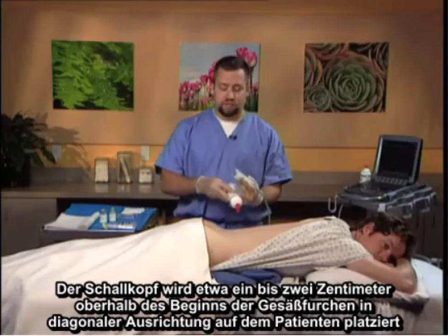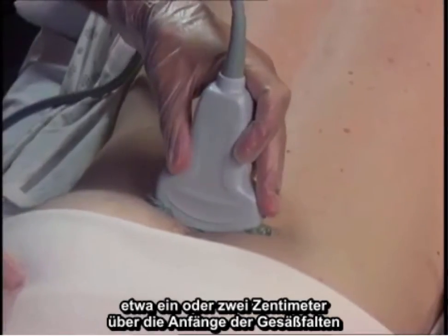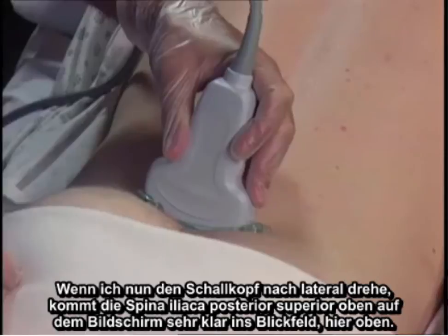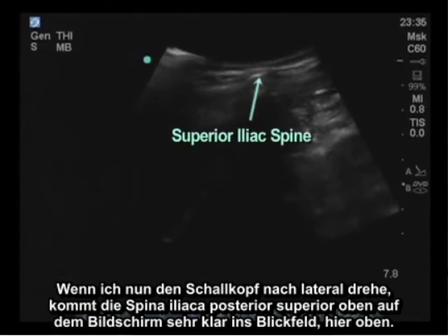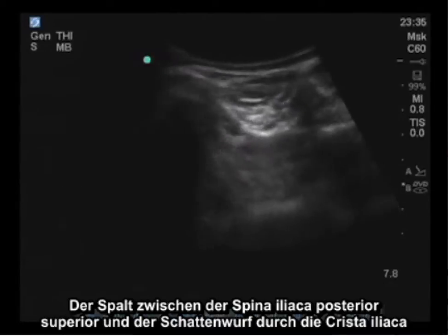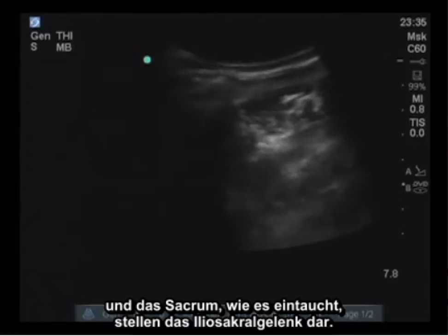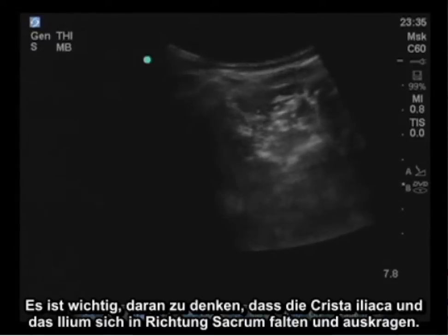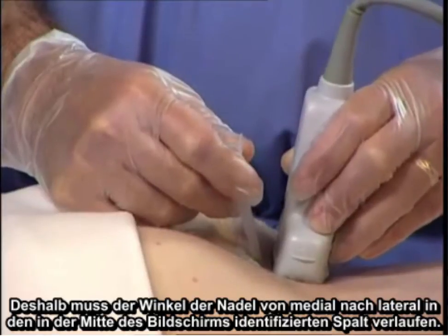The probe is placed on the patient in the transverse orientation approximately a centimeter or two above the beginnings of the gluteal folds. I've found the anatomic midline by identifying the spinous process of the sacral plate. As I roll the probe laterally, the posterior superior iliac spine comes into view clearly at the top of the screen. The space between the posterior superior iliac spine and the shadow cast by the iliac crest and the sacrum represents the sacroiliac joint, visible in the center of the screen. It is important to remember that the iliac crest cantilevers towards the sacrum, therefore the needle angle needs to track from medial to lateral into the space identified.